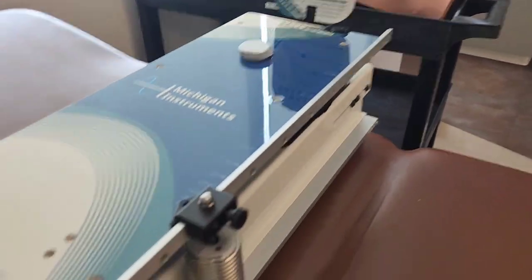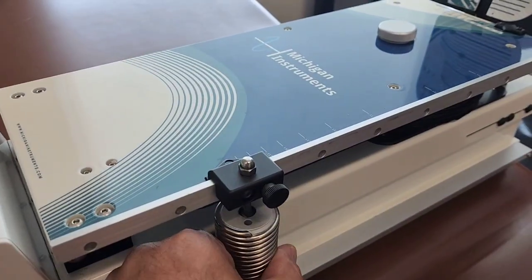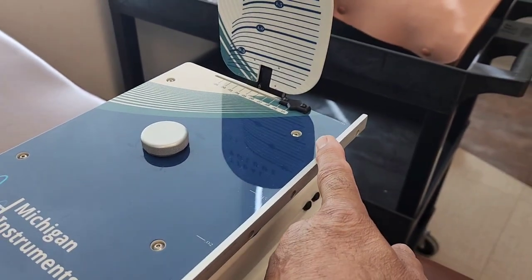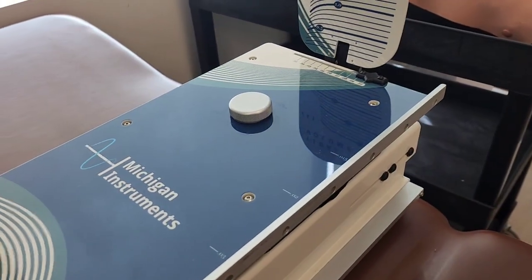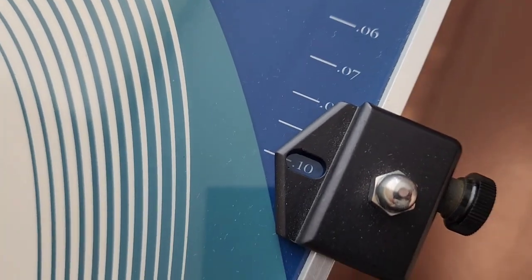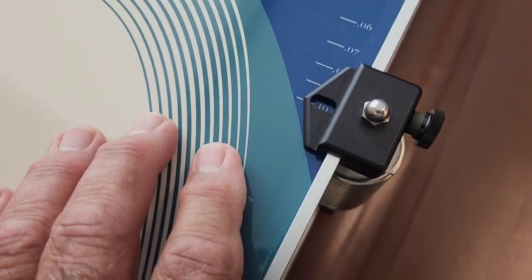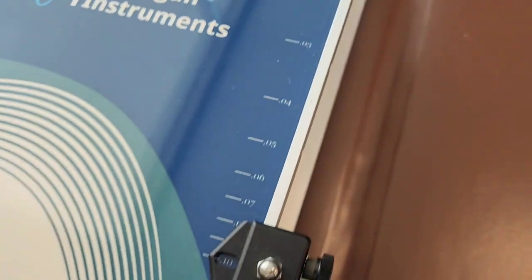Okay, and real quick review. There's a couple parts on this that we're going to talk about. That one adjusts the compliance. This is the spring that adjusts compliance as we slide it up to the top of the lung. There, it's going to create less compliance. So right now this is the minimum location. You don't want to have it set lower than that. So it's 0.10 is where you will always start this lung simulator, and then as we decrease compliance, we'll move it up, and you'll see what it looks like on the waveform.